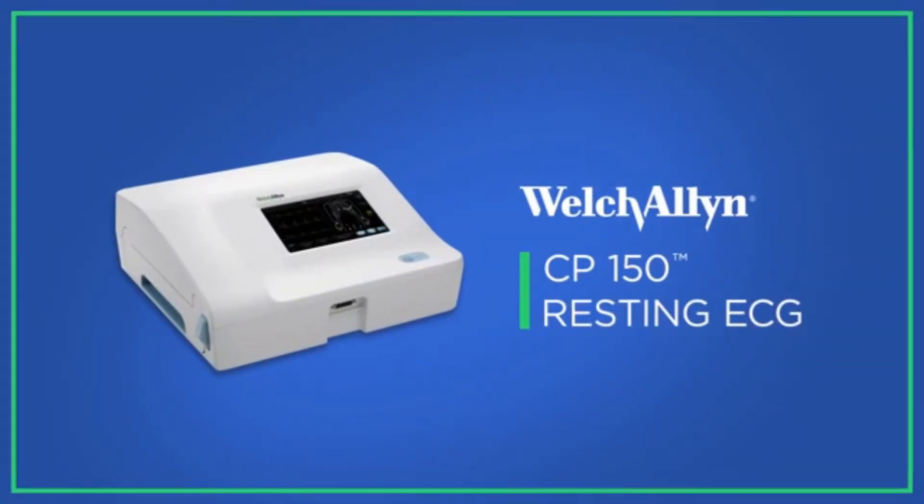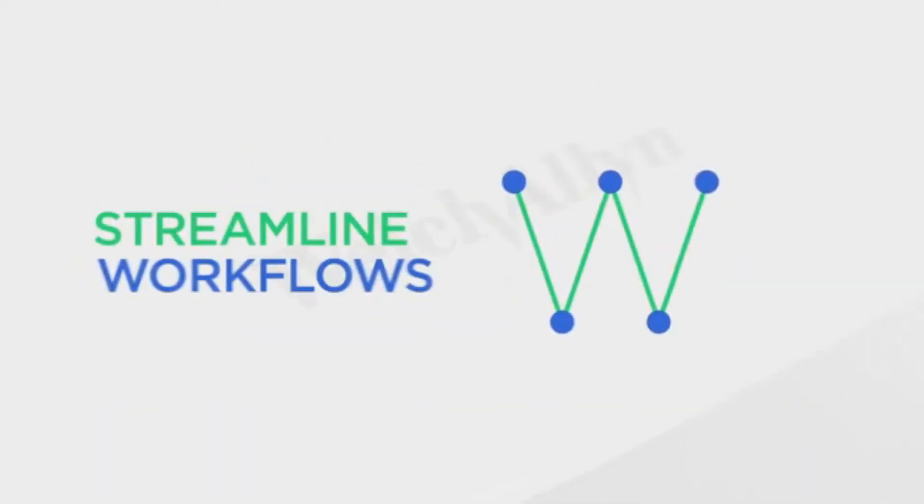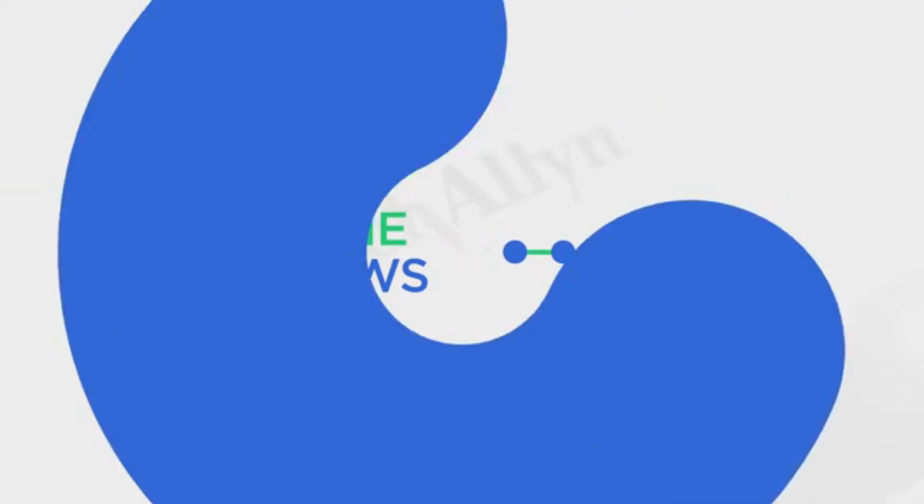Welcome to this demonstration of the Welch Allen CP150 electrocardiograph, reviewing the device's key features and optional capabilities. The CP150 is simple, fast, and connected — designed to help you improve efficiency and streamline workflows.